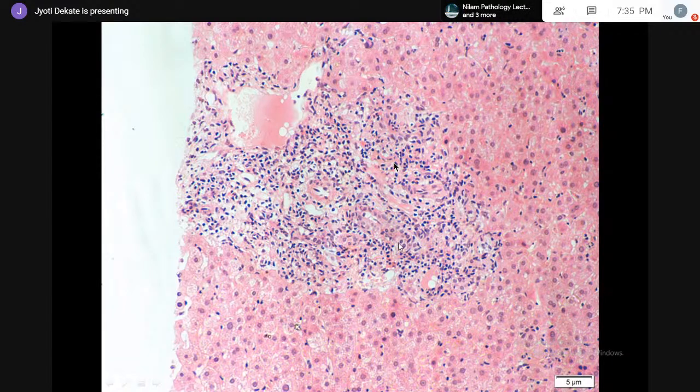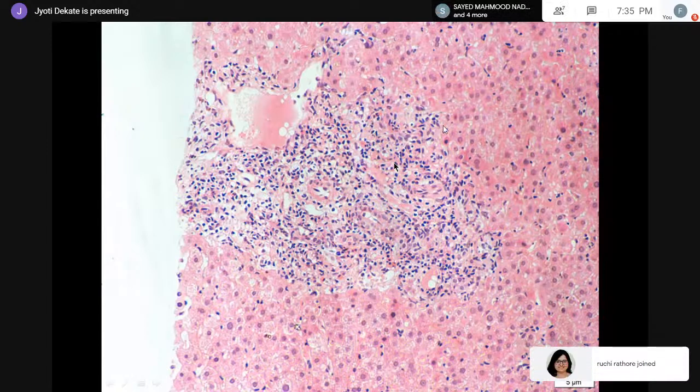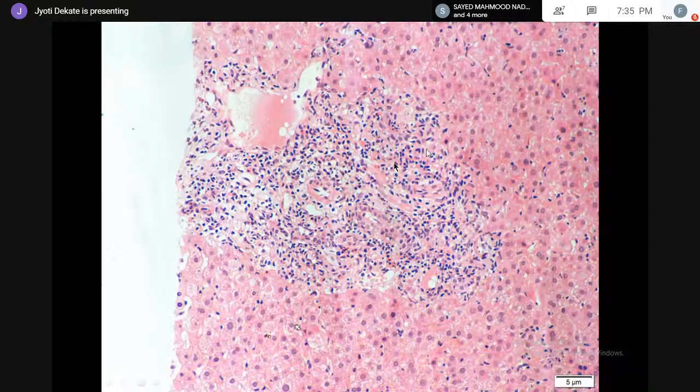This is the bile duct here. It is infiltrated by these mature appearing lymphocytes, causing the duct damage. The portal vein here, again we can see that these inflammatory cells are undermining the subendothelial space and causing uplifting of the endothelial cells. In addition, there is spillover of this inflammation onto the adjacent periportal hepatocytes, causing hepatocyte damage.